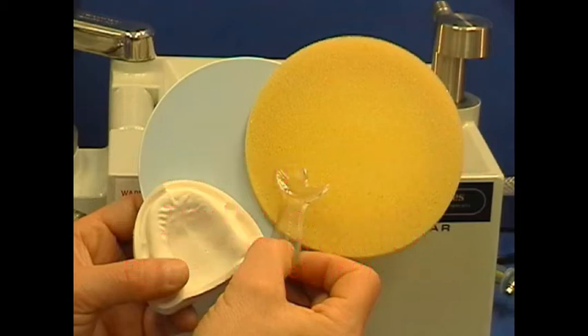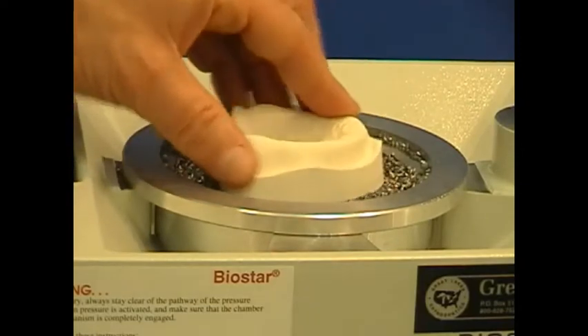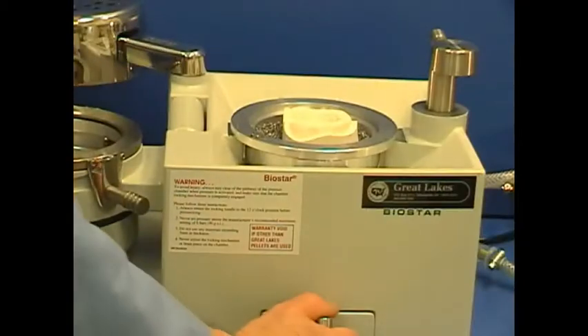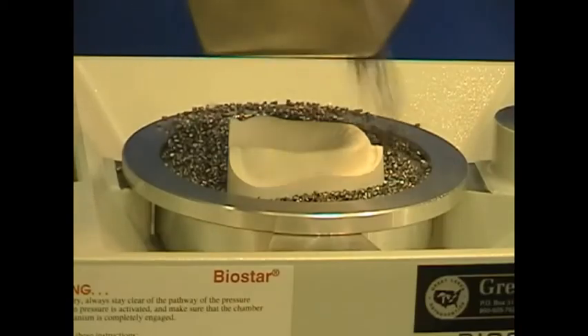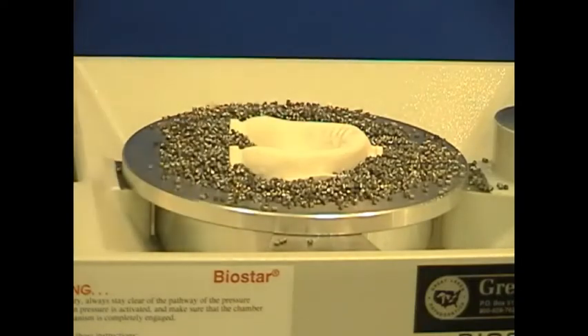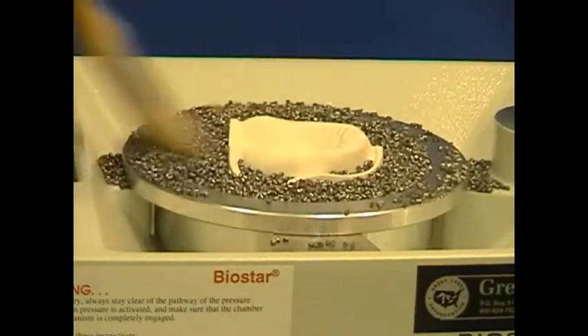The stone construction model is prepared for tray fabrication. Identify moderate dental undercuts and relieve using Snapstone or Great Lakes Light Cure Blackout Gel. Place the model into the pellet cup with the heel facing to the left side of the machine, and elevate the model so the top edge of the model base is at the same height as the cup's rim. Fill in pellets between the model and cup's rim and sweep level with the brush, making sure there are no pellets remaining on the cup's rim.